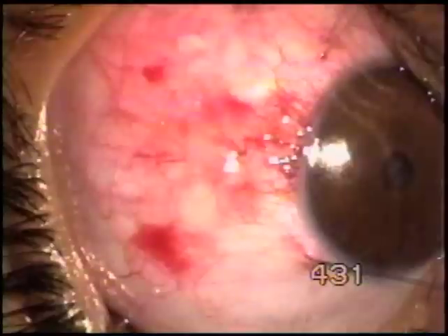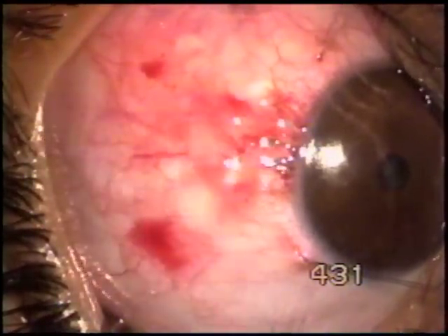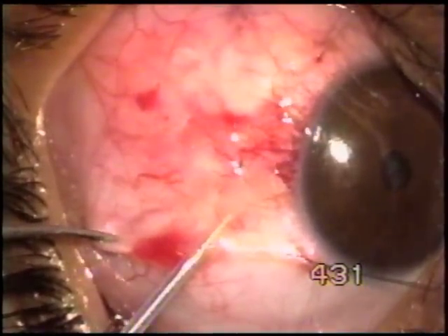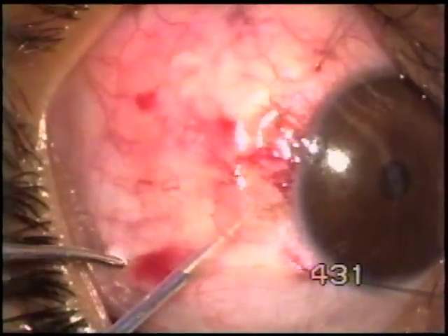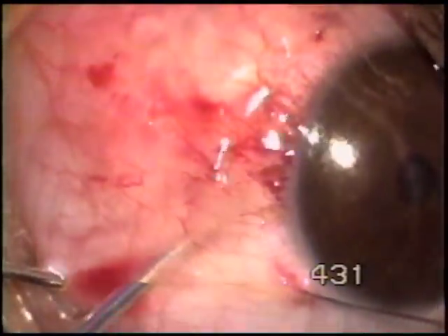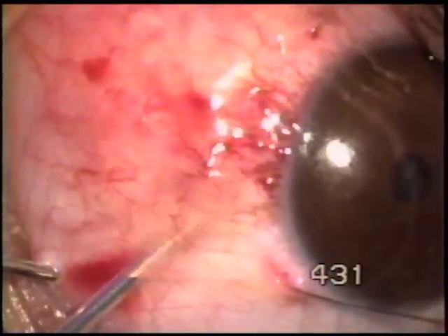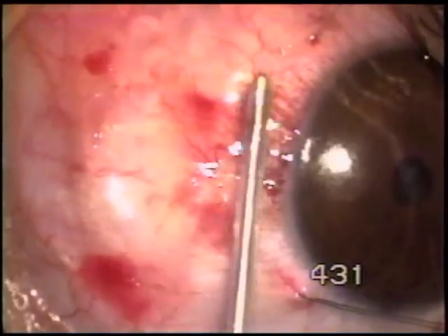I first touch the lesion, then activate the tip momentarily. Going close to the limbus, the tip is activated for a longer period.